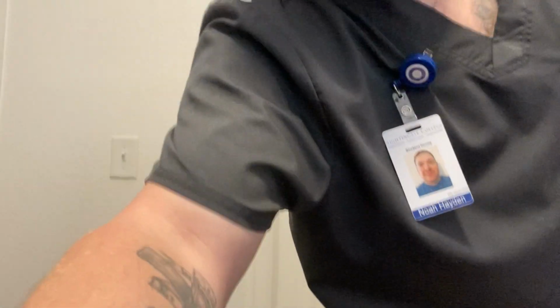Hello, Mr. Smith. My name is Noah. I'm going to be your nurse today, okay? I'm going to provide Mr. Smith with some privacy and perform hand hygiene.